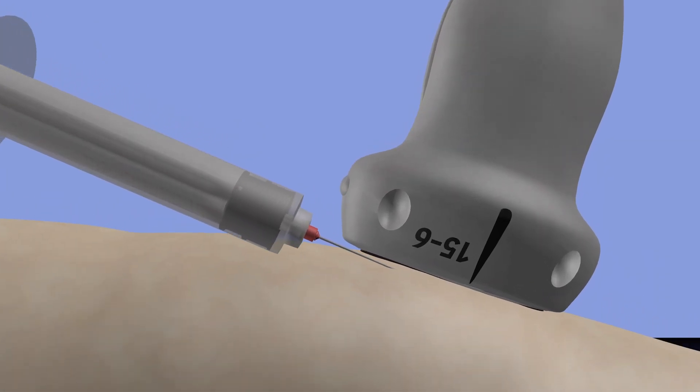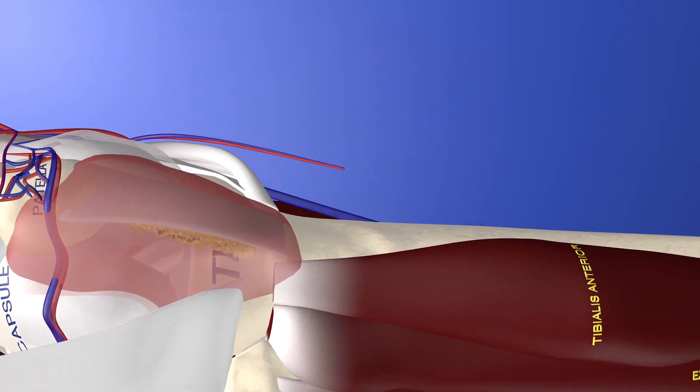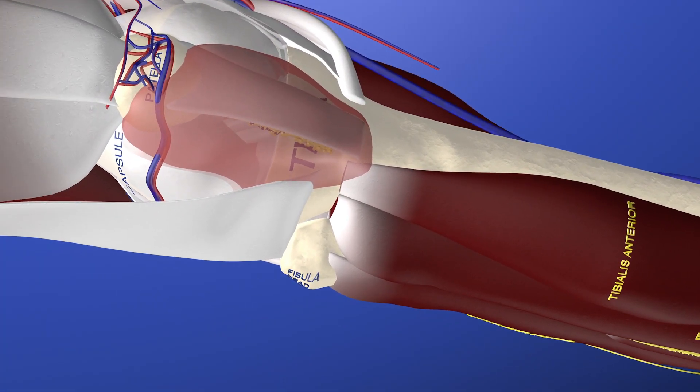Here we are starting our procedure. Essentially we're going from proximal to distal, withdrawing fluid out of this Morel-Lavallée lesion. Here's an anatomical depiction where you can see this large fluid collection anterior to the patella and the patella tendon. We're rotating around this lesion to get a better sense of its pathology.